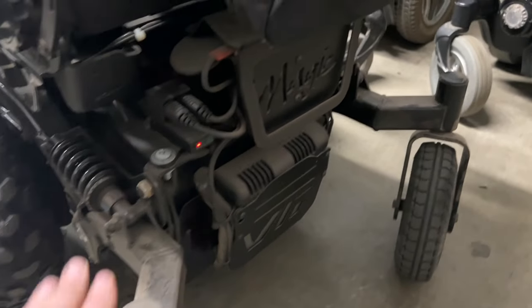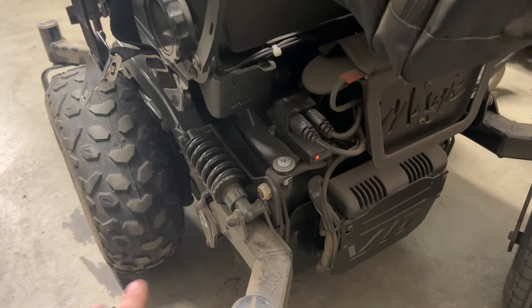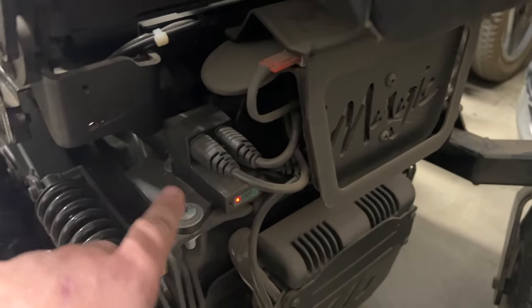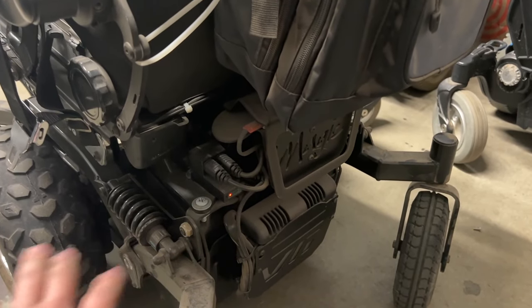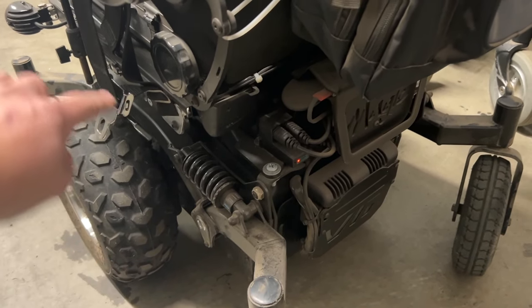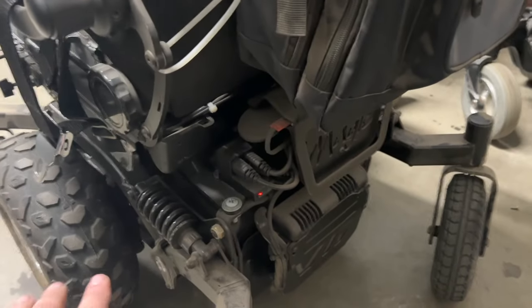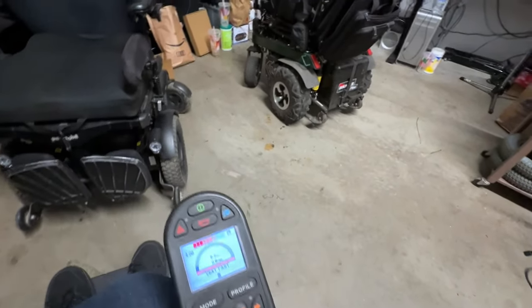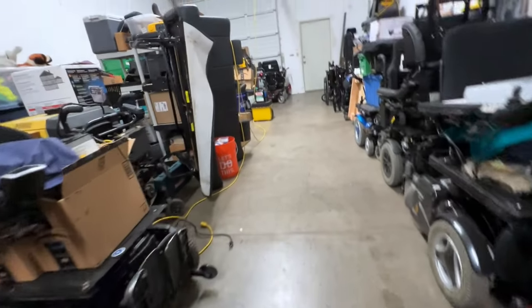All tires aired up. A long time ago I upgraded this to a 120 amp controller, which gives the motors a little more grunt and also helps them run more efficiently. There's a gyro back here — a standard RNet single axis unit running in passive mode, indicated by the red light — just for backup safety. It doesn't affect steering performance, but if the chair tries to spin around catching a curb or dirt, that thing will stop me. Now we're all suited up and ready to go find a spot to run this thing.